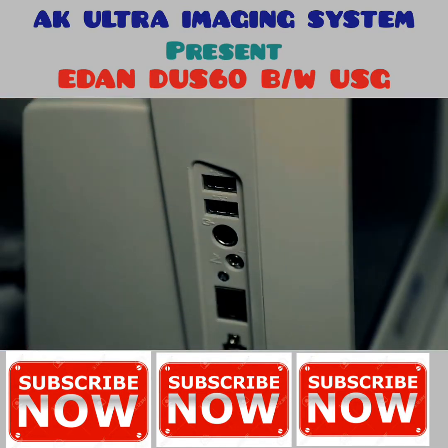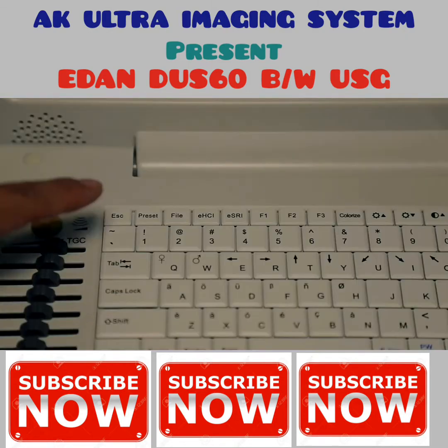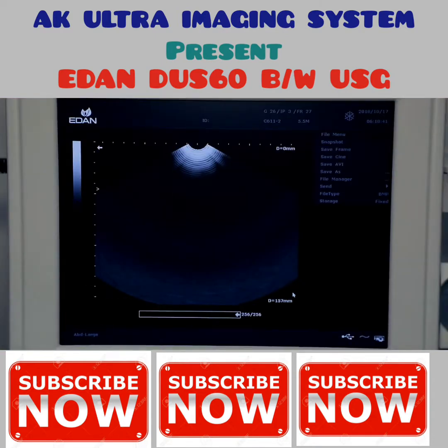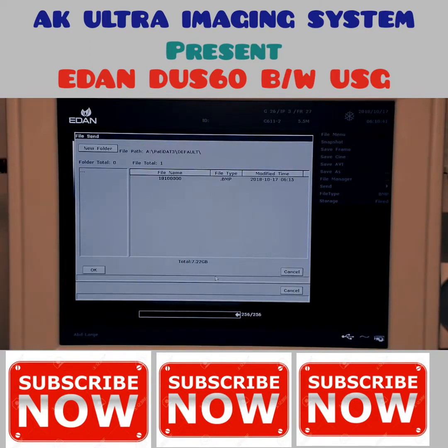To transfer images, connect a USB to the USB port on the side of the unit. Press the file key, highlight file manager using the trackball, and press set. Double click on file manager display, select a drive under destination, highlight all images to be transferred, and press file send — all highlighted images will then be transferred.